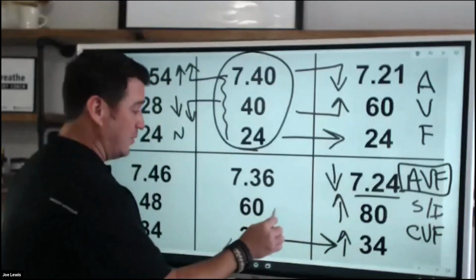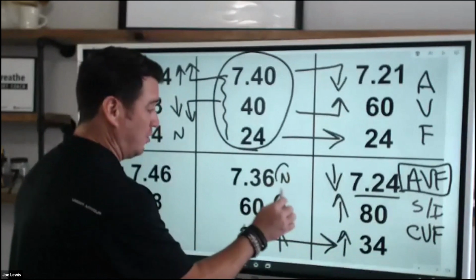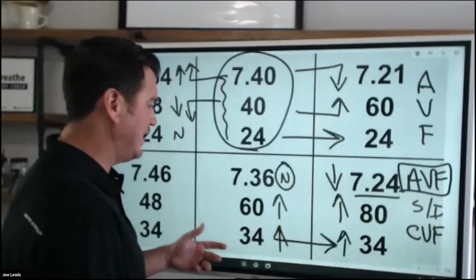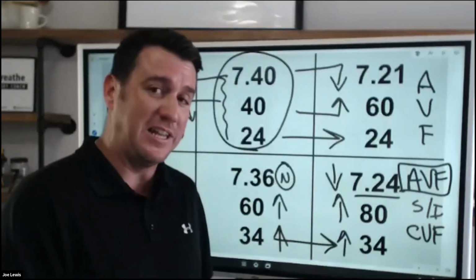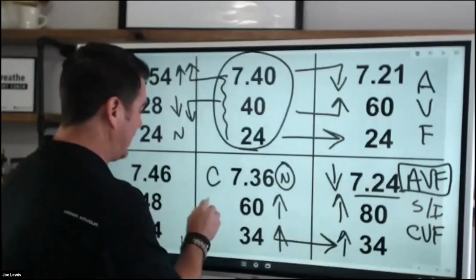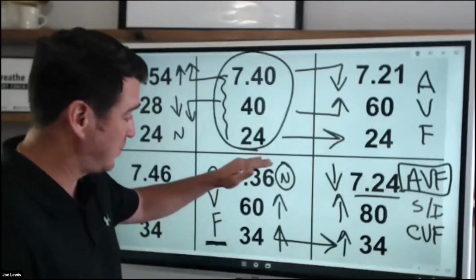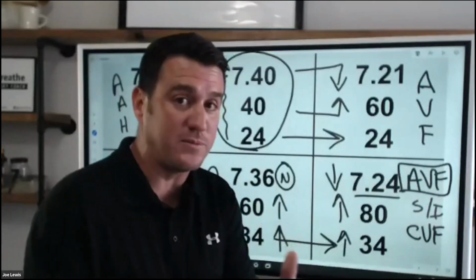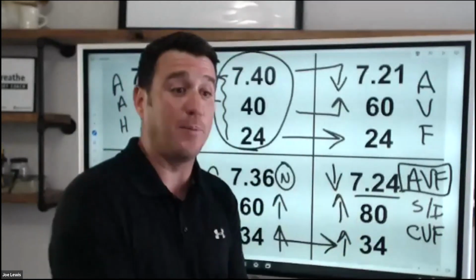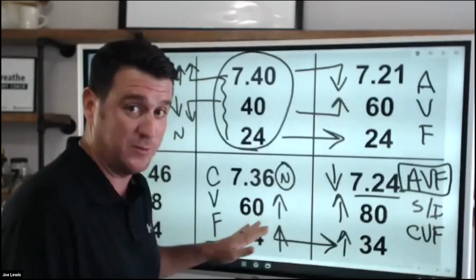Now over here, we see high CO2, we see elevated bicarb, we see normal pH. Well, okay, this is fully compensated respiratory acidosis. This person lives here, again, chronic ventilatory failure. This is their normal. This person does not need your intervention in terms of trying to help them get rid of this CO2. This is where they live. So don't mess with that.